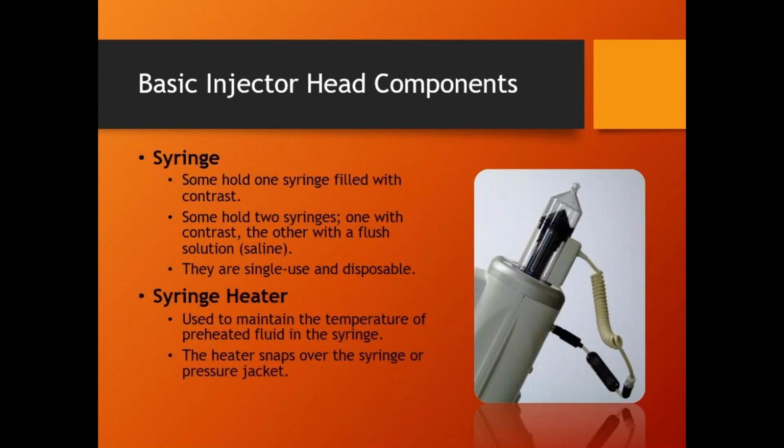The syringes, what do I say here? Some hold one syringe filled with contrast, some hold two syringes. Now, angio injectors, just one syringe. The angio injector, where I was talking about special procedures, cath labs, they don't use saline in those procedures. It's just the nature of the beast. They don't need the saline for enhancing the images.